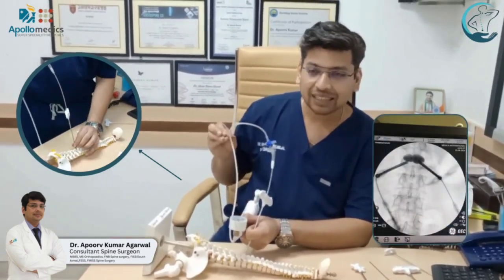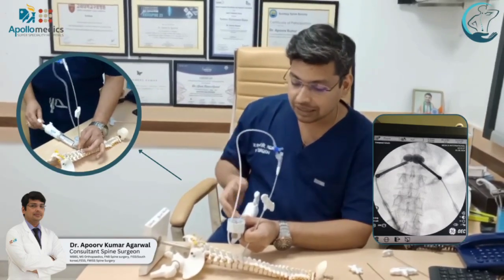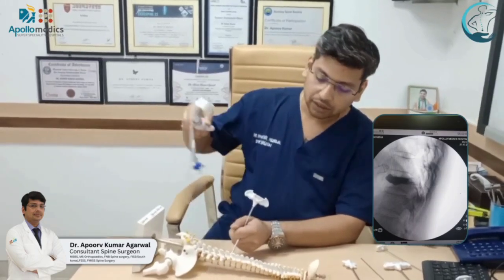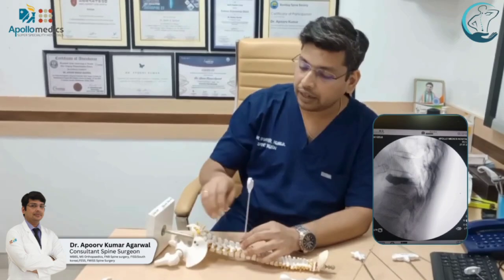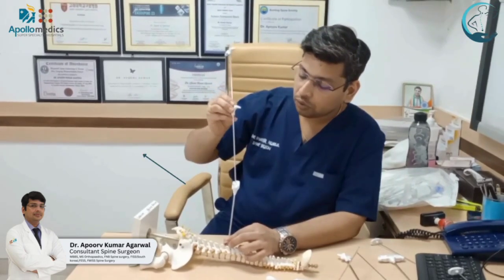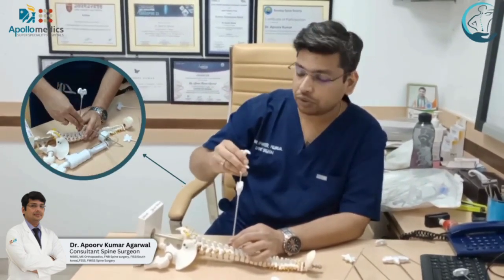Once that is done, we make our cement ready, which usually takes around 3 minutes. Once ready, we deflate the balloons and remove them. The assistant has kept the cement ready in the fillers — these are the syringes containing the prepared cement — and we then go into the vertebral bodies through the working channel using these fillers.